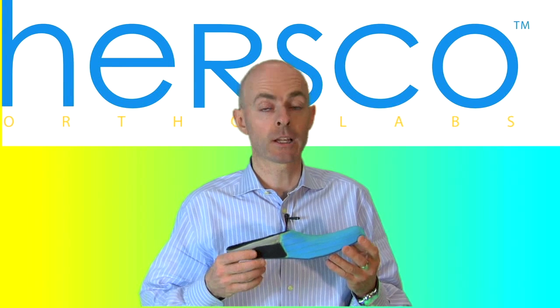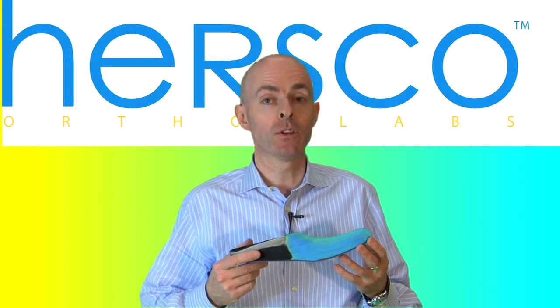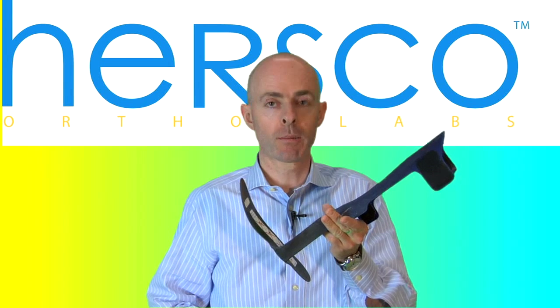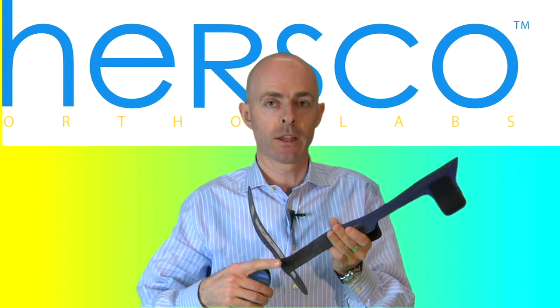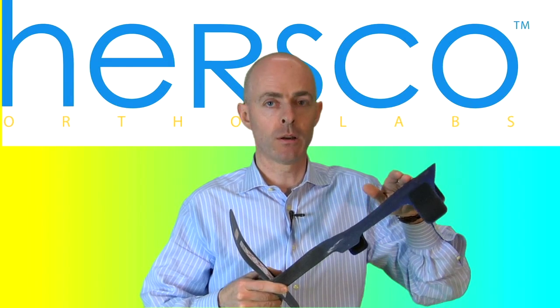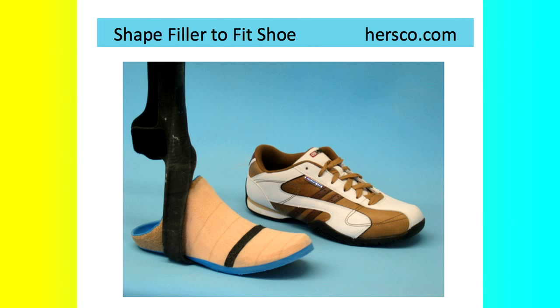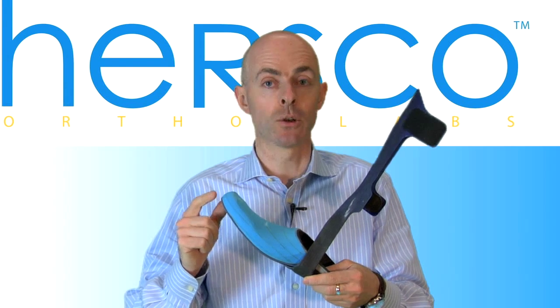This you would do in conjunction with the actual shoe that the patient is going to wear the device in. These partial foot prostheses can then be used quite easily in conjunction with dynamic carbon AFOs. This is an example of a dynamic carbon AFO with a full length foot plate and a lateral strut that then proceeds up the lower leg and becomes a shield on the tibial crest. The foot orthosis portion with the partial foot prosthesis can be machined directly to match and fit the contour of the foot plate and also machined so that it fits inside the shoe that the patient is going to wear.